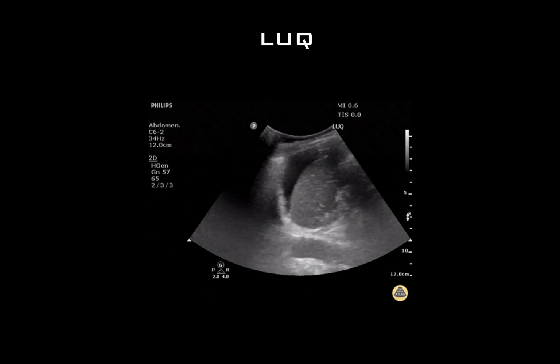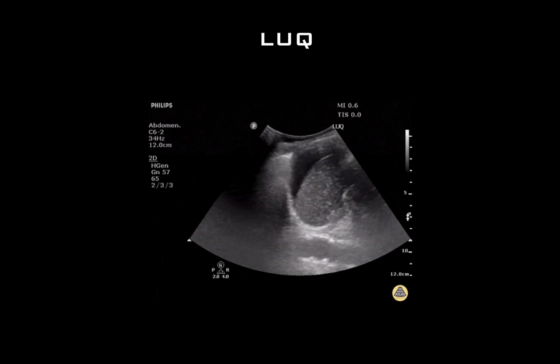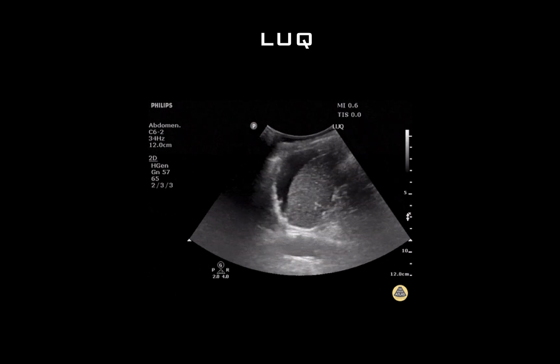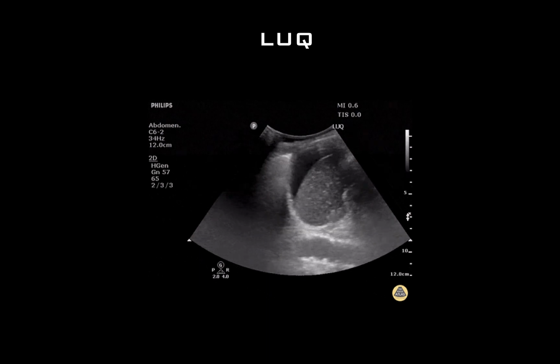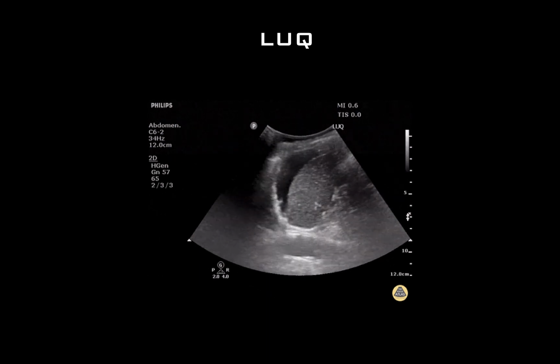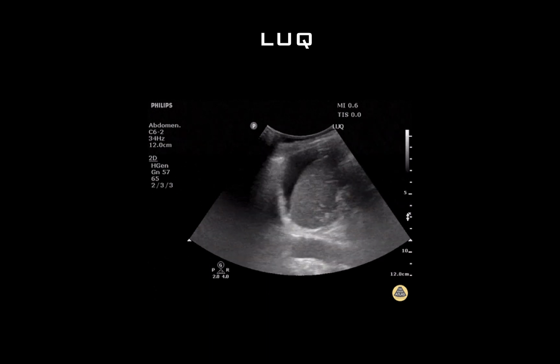Here's an example of a tachycardic hypotensive patient following a colonoscopy. A RUSH exam was done in this patient and includes this left upper quadrant view demonstrating intra-abdominal free fluid. Following this finding, a CTA of the abdomen was obtained urgently, which demonstrated a splenic rupture secondary to overzealous manipulation of the colonoscopy probe around the splenic flexure.